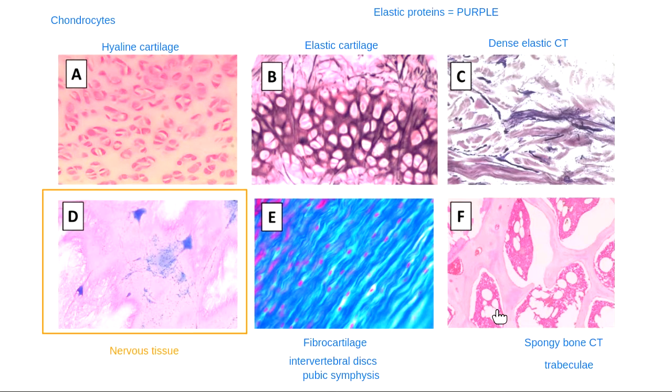I mentioned this morning, but when you look at the guided lesson, make sure to pay attention. There's 2 kinds of spongy bone images that we see. Some of them just have red in this bone marrow area, and some of them will have purple pink in this bone marrow area. But anytime you look at spongy bone, you're always going to see an area where there's solid tissue, that's the bone tissue, and then you're going to see a mass of little cells that are all grouped together. That's the bone marrow. So spongy bone has the bone marrow in it, and then it has the bone tissue arranged in trabeculae.